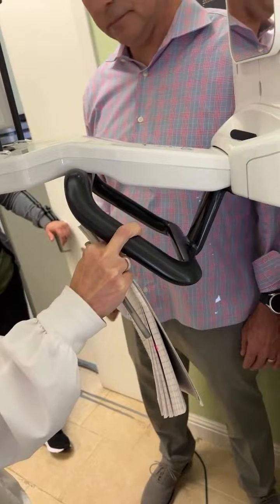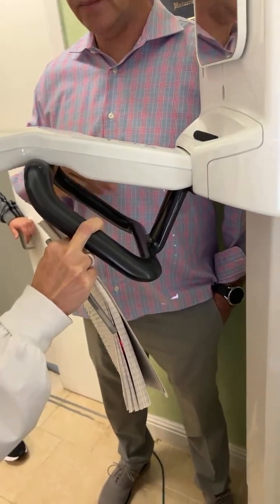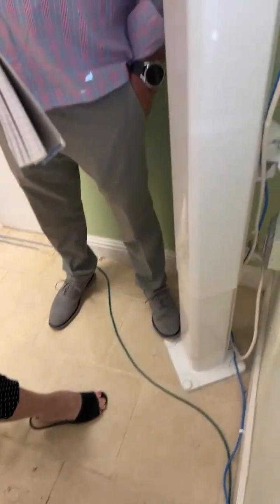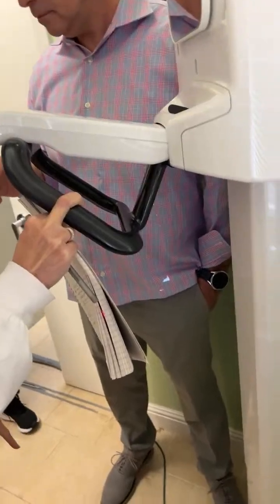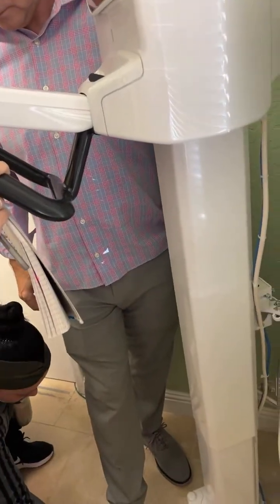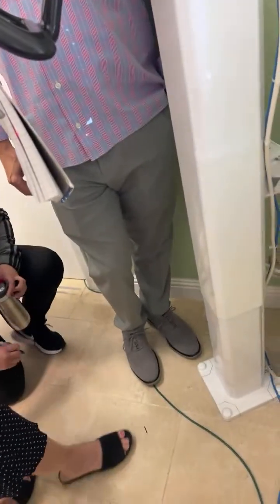Can you guys mark right here so we can put the tab later on? Does that make sense? It's just basically 1 foot away. Just 1 foot, a little bit bend in the body. That's good.